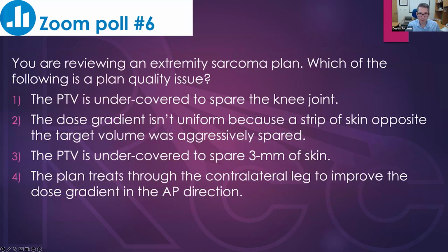All right, last poll question. You are reviewing an extremity sarcoma plan. Which of the following is a plan quality issue? And Minsun, this is my last slide, so feel free to send any questions my way.